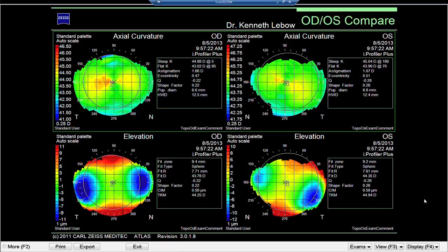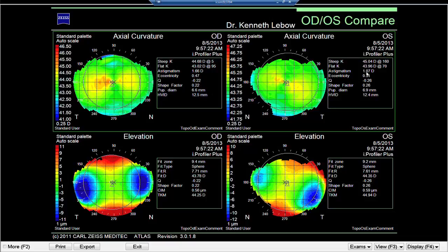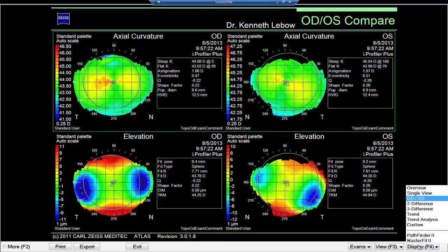The first thing I'm going to look at is the right-left compare maps. For Beth, there's really nothing out of the ordinary. You can see against-the-rule corneal astigmatism in the right eye and then a slightly oblique against-the-rule corneal astigmatism in the left eye. She has just over a diopter and a half of against-the-rule astigmatism on the cornea, and refractively her right eye has two diopters of against-the-rule astigmatism.